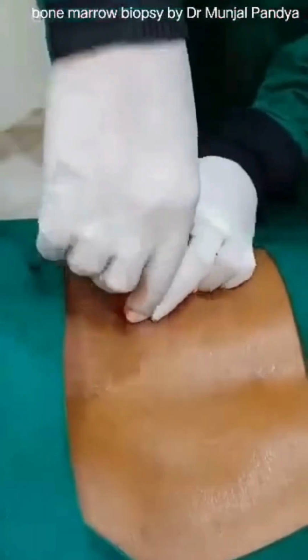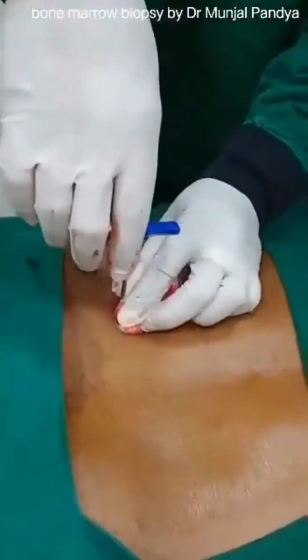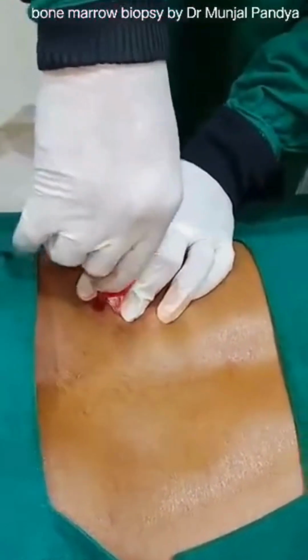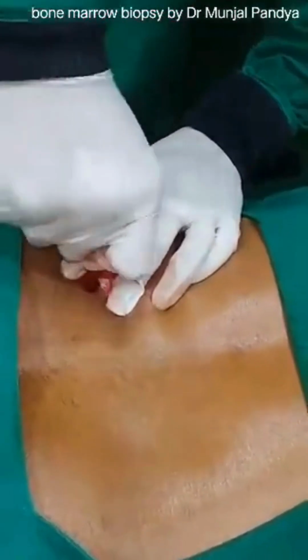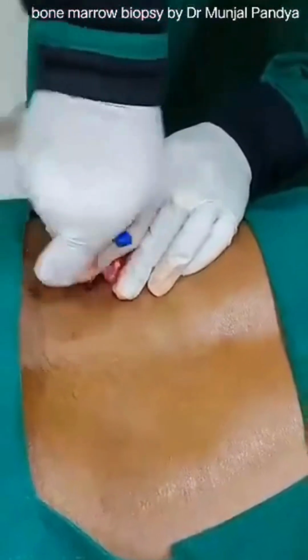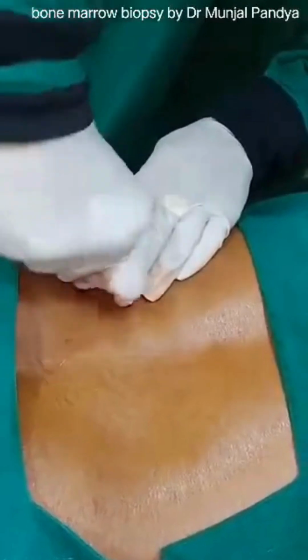So now see, whatever the length of the trephine I need, I make some mark. You see my finger. So from the finger I will enter into the bone. I am going in a circular fashion. Relax, it's done, brother.